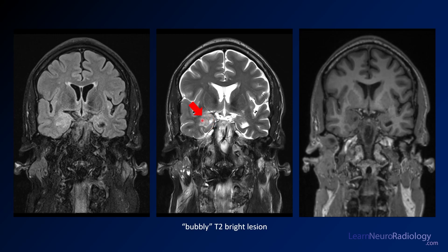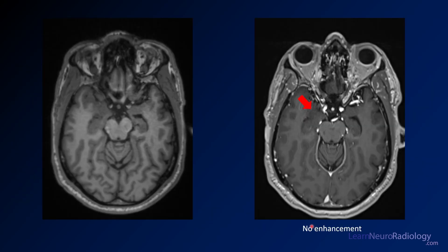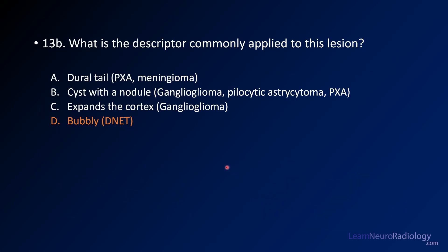Here the coronal T2 shows it best — you've got this kind of multi-lobulated lesion in the medial temporal lobe going into the hippocampus. On FLAIR, it's sort of ill-defined and expansile. On T1 you can see the medial temporal lobe is expanded. Here's the pre and post contrast — there's no enhancement of this lesion. So you've got a medial temporal lesion with no enhancement, and we have to think about low-grade tumors like ganglioglioma, DNET, maybe PXA or pilocytic astrocytoma.